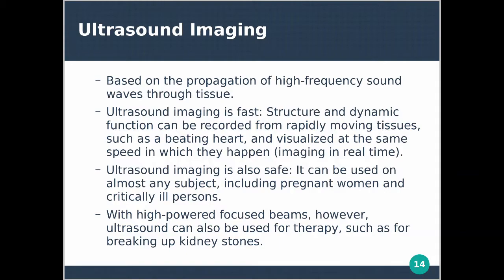It's also safe. It can be used on almost any subject, including pregnant women and critically ill persons. Unlike X-rays, which are ionizing radiation, ultrasound imaging is very safe. It doesn't cause damage to your tissues. It doesn't cause damage to your DNA. That's why it's the imaging technique of choice in viewing babies inside the womb of mothers.